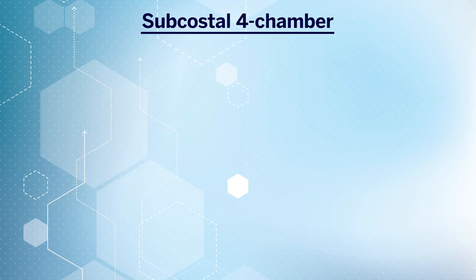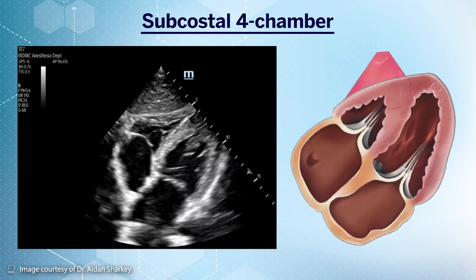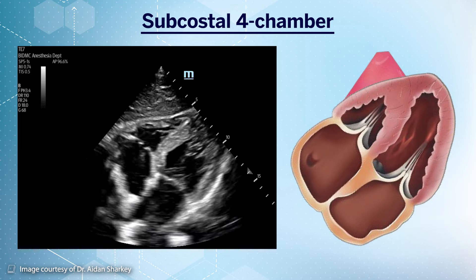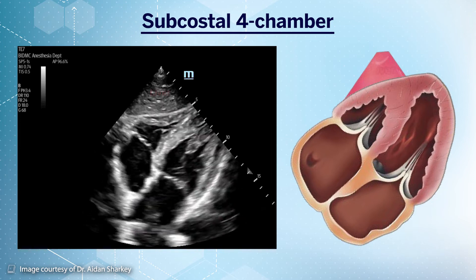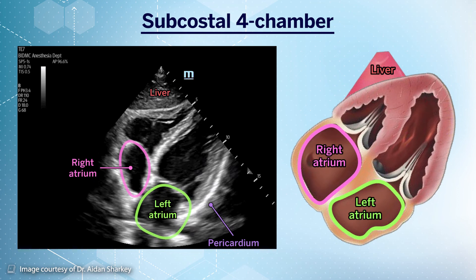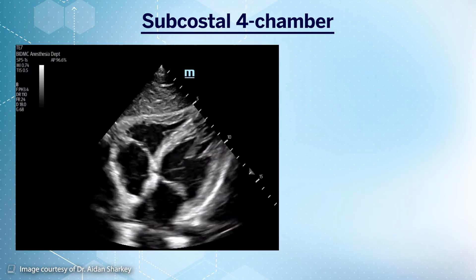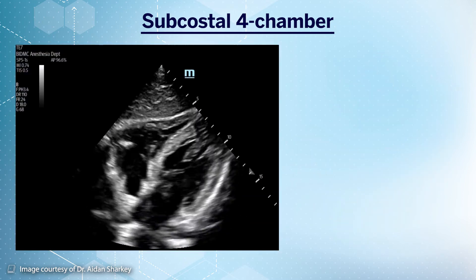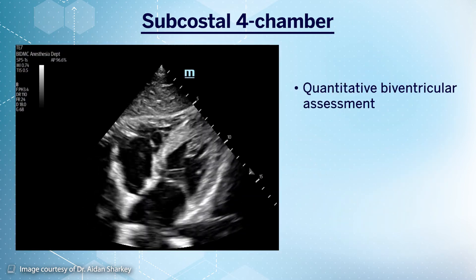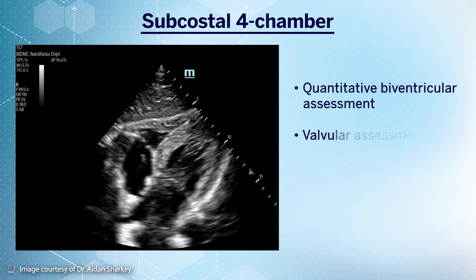The standard view in this window should appear as depicted in this video loop and cartoon representation, where we should be able to identify the liver, the pericardium, along with the two atria and two ventricles of the heart. This view is similar to the apical four-chamber view in its ability to grossly assess biventricular function, along with some advanced uses such as valvular assessment.